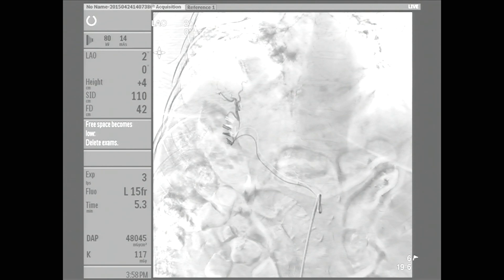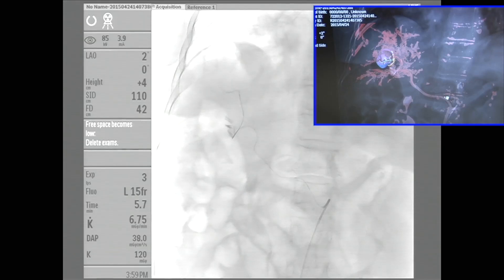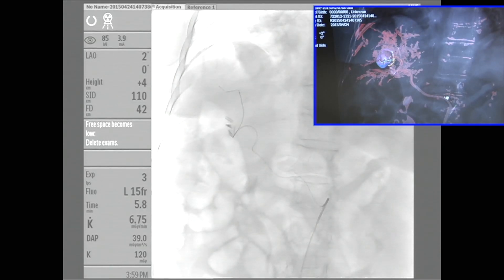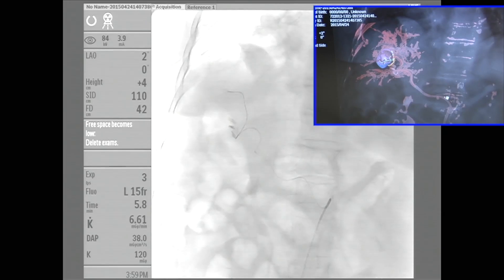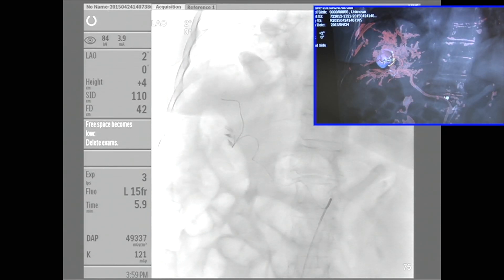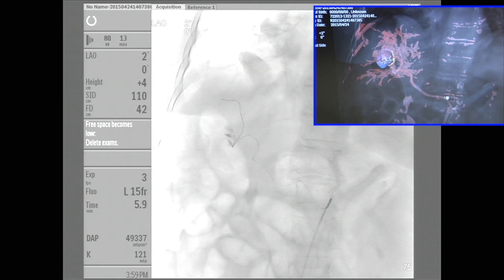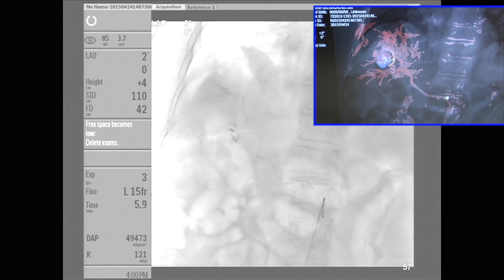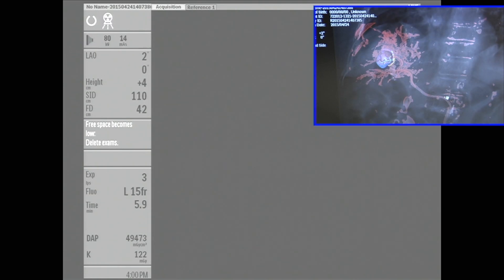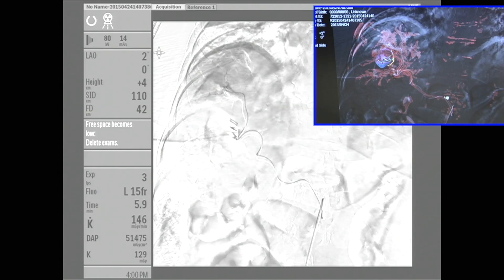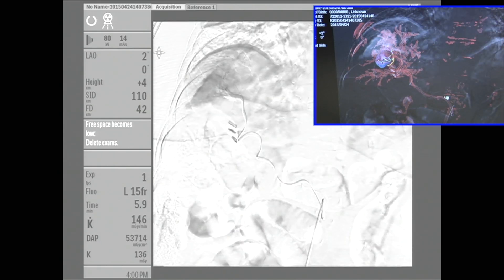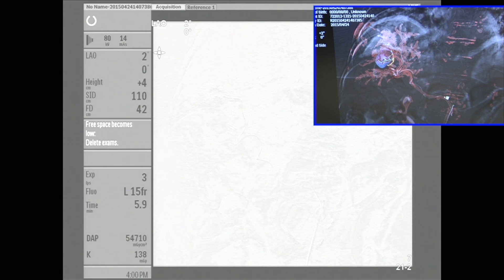I agree it's okay to go from here because we are not going to any of the inferior vessels going to segments 5 and 6. She has very corkscrew vessels because of her cirrhotic liver — that's expected. Let's see if we can get a little more subselective. What we'll do is perform our DEB-TACE, and then to confirm, I like to do a non-contrast cone beam CT at the end because the contrast is still retained within the tumor. We can see if we missed any tumor-feeding vessels. This is what we'd call super-selective.